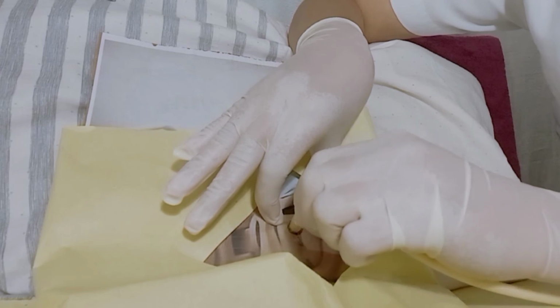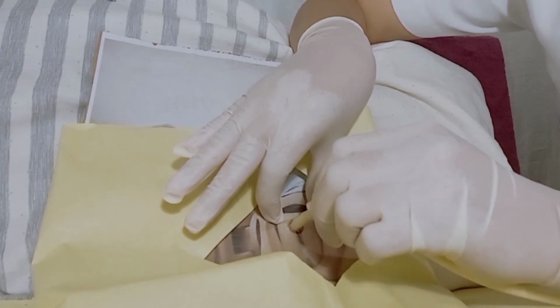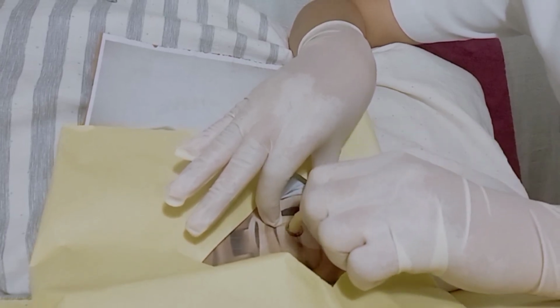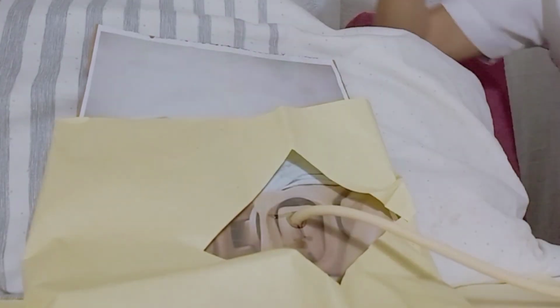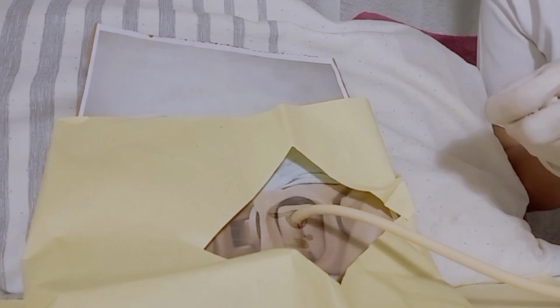With the thumb and first finger, pick up the catheter about 1.5 to 2 inches from the tip. This gives the midwife control of the catheter tip, which easily bends. Carefully gather the additional tubing in your hand, which gives good control of the full catheter length.